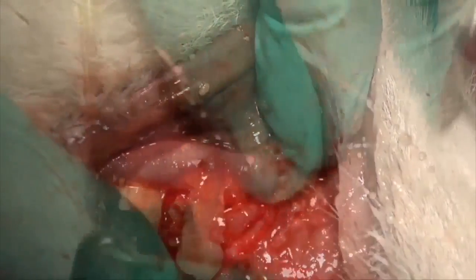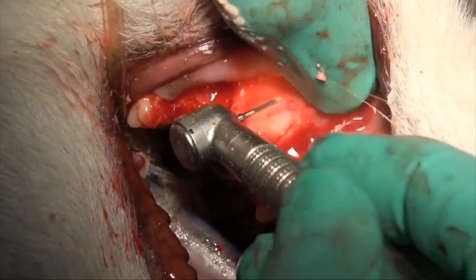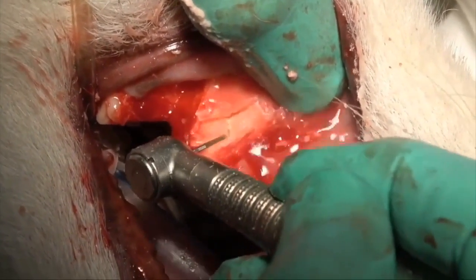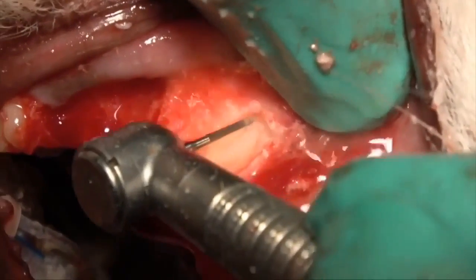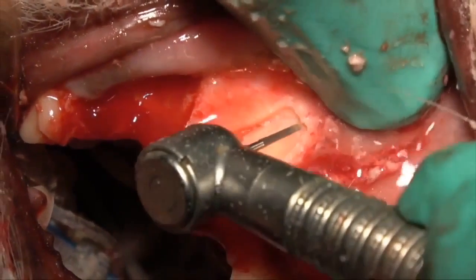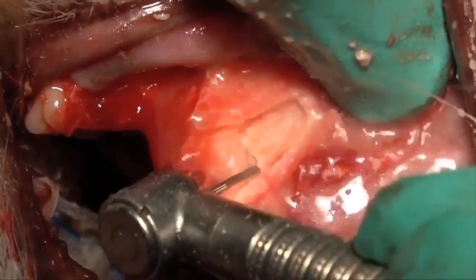What we need to do is come back here with our cross-cut tapered fissure burr and remove more of the vestibular bone, increase the groove depth on the distal and mesial aspect. And as you see there, we're kind of going up underneath on the coronal portion of the root tip, just to release it from the bone a little further. Once we complete that, we'll be able to come in with our luxator and remove it.